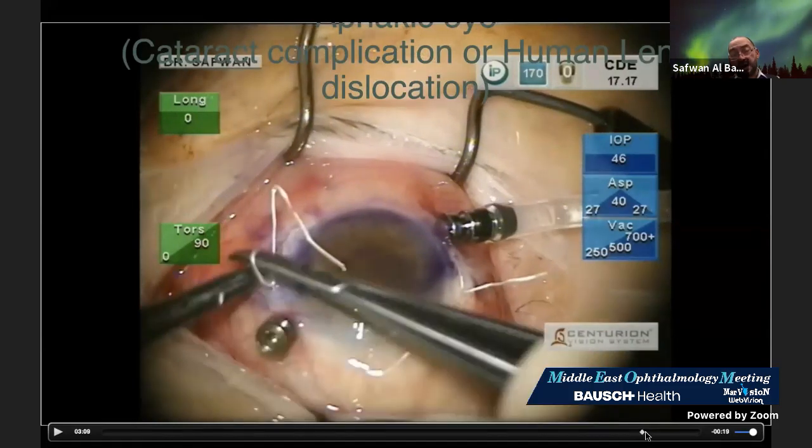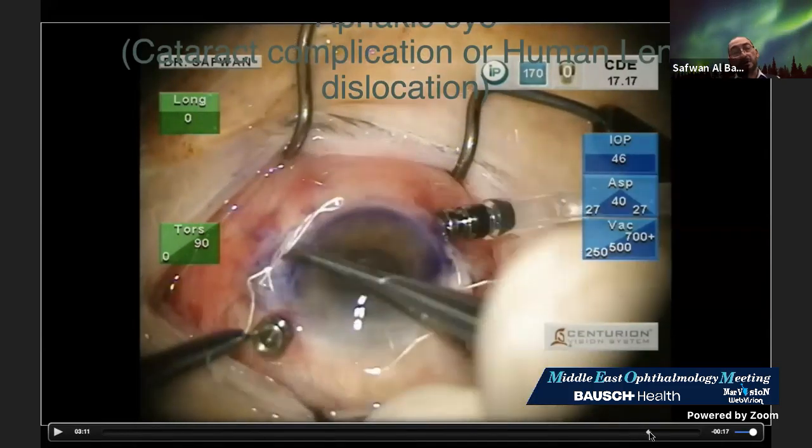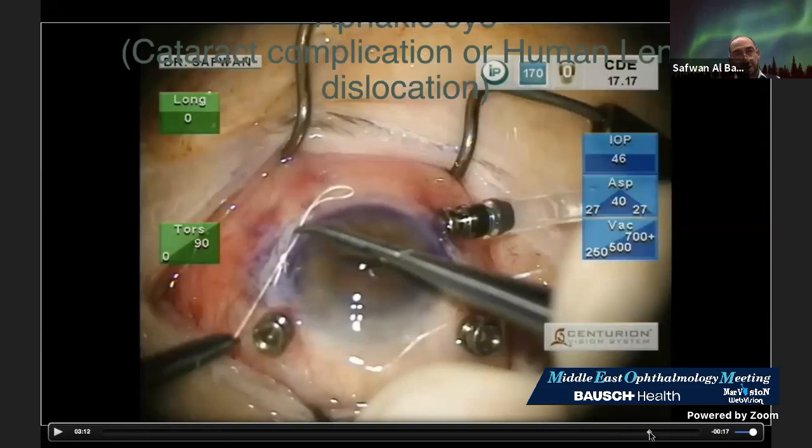1, 2, 3, and then that's all. We don't need to create any tension. So that's why here I need to stop, because Aspen mentioned one thing related to the mobility of the lens, and when the human being turns his head, the lens will move with it. I don't think that it's true with the Goretex suture.